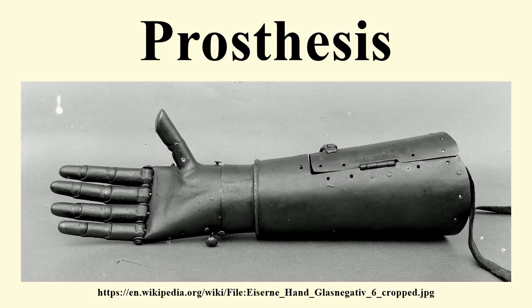Types. A person's prosthesis should be designed and assembled according to the patient's appearance and functional needs. For instance, a patient may need a transradial prosthesis but need to choose between an aesthetic functional device, a myoelectric device, a body-powered device, or an activity-specific device. The patient's future goals and economical capabilities may help them choose between one or more devices.